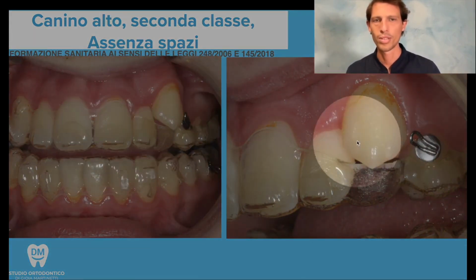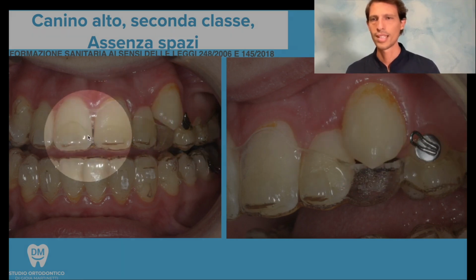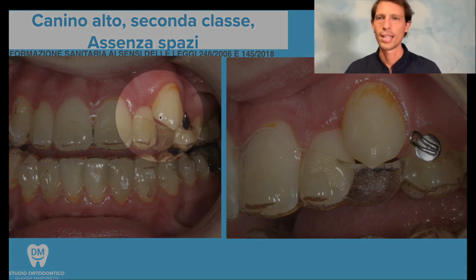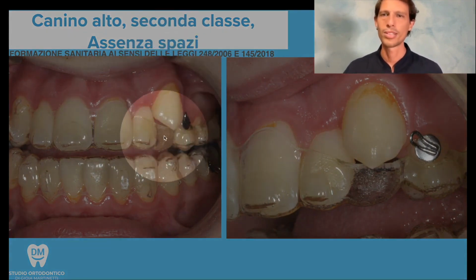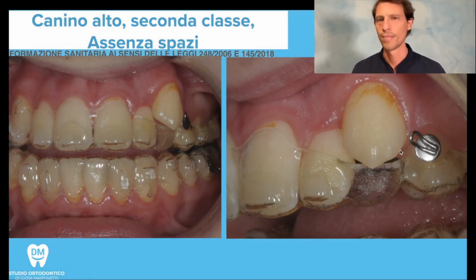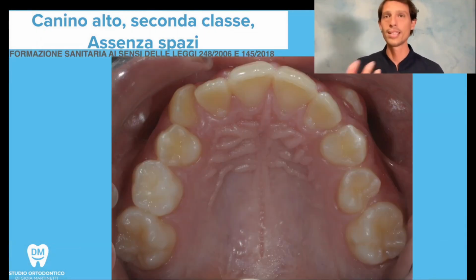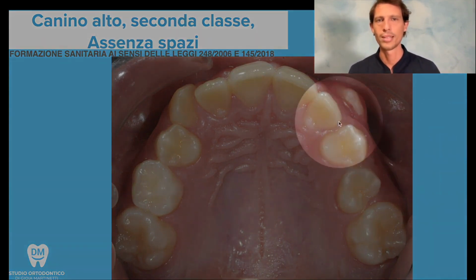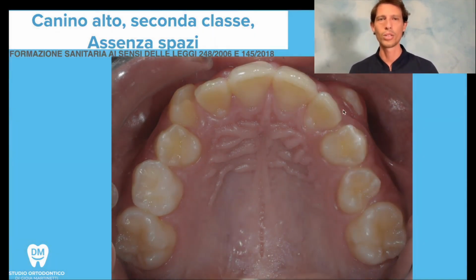This is the famous button. You can see that during the treatment the teeth become aligned. But this canine is so far out that it even sticks out beyond the aligners we had planned. This is the progression of the case in the upper arch, so the initial situation was completely no space for the canine.